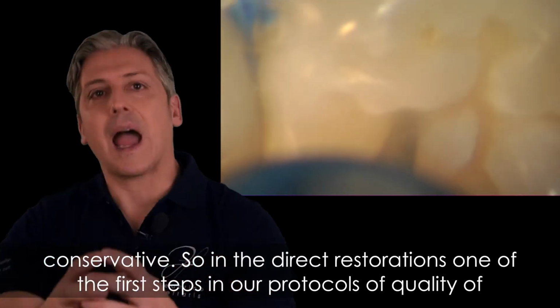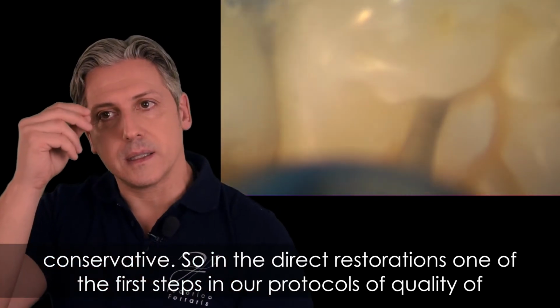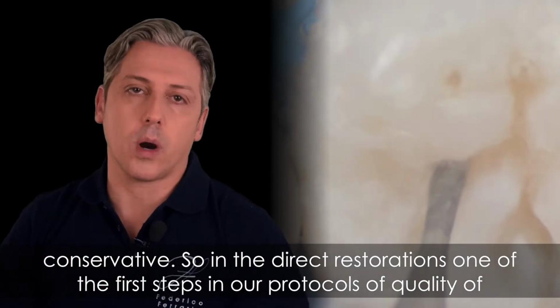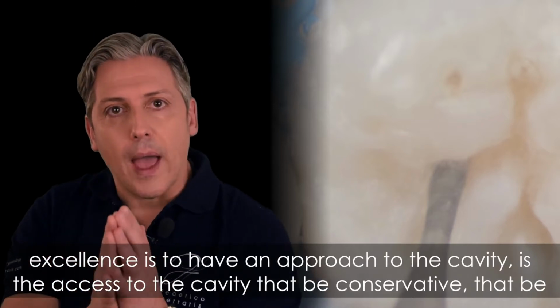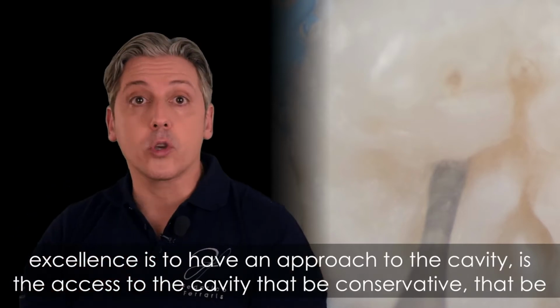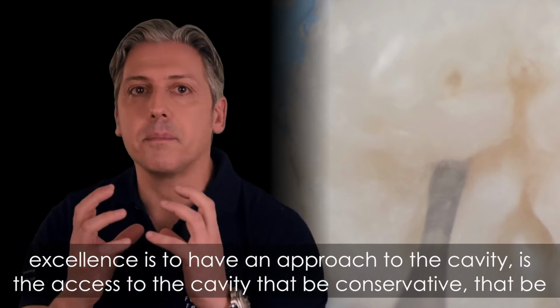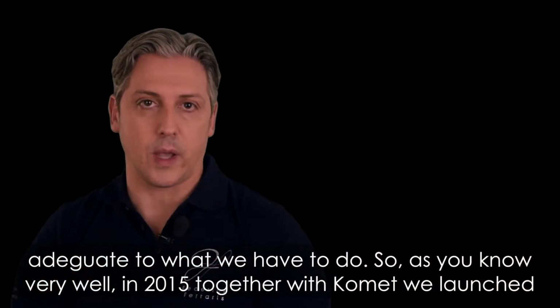So in direct restorations, one of the first steps in our protocols of quality, of excellence, is to have an access to the cavity that is conservative, that is adequate to what we have to do.